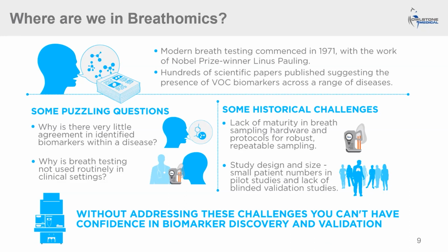Where are we currently in breathomics? Modern breath testing started with Linus Pauling back in 1971, and over the last 50 years, there have been hundreds of scientific papers suggesting the presence of VOC biomarkers across a range of diseases. One thing that becomes clear in going through these papers is that there is little agreement in biomarkers associated with particular diseases. That probably answers the puzzling question of why breath testing is not yet used routinely in clinical settings.